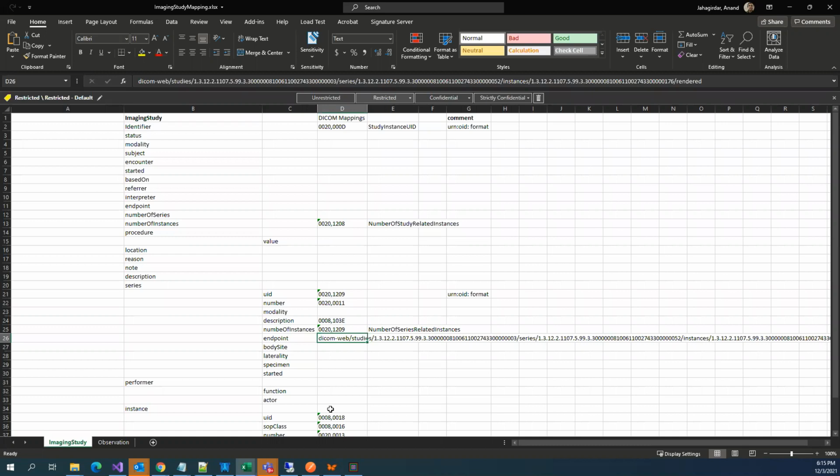Right now, what I had thought when it was originally envisioned, we wanted to have this one simple .NET application which will do DICOMweb queries, and then it maps to Scriban templates, and it uses a FHIR client to post it to FHIR. That, in my opinion, we have open sources everywhere. We could just put all the pieces together and do it.